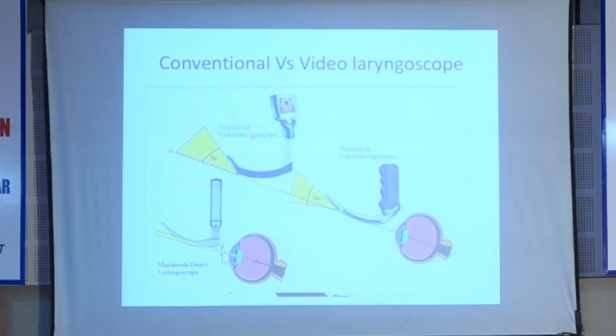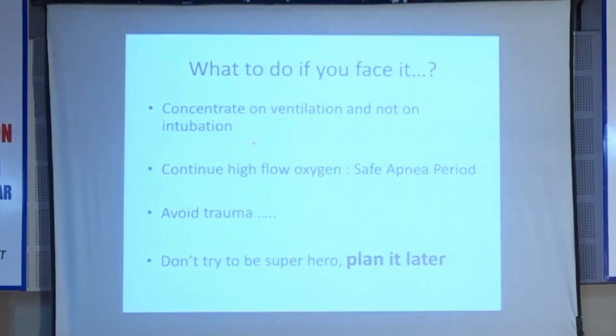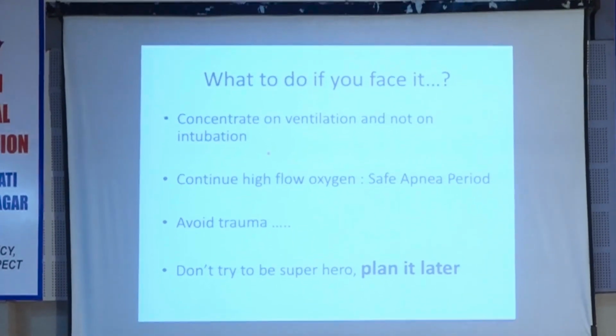The larynx is visible, but intubation is a bit difficult because there is some learning curve for the use of a video laryngoscope. Now, whenever you face such a situation, always concentrate on ventilation and not on intubation. Intubation is always elective. You can call an expert for that. But if ventilation is a problem, you are going to be in a soup. Patient will not die of hypercarbia. Patient will die of hypoxia. So avoiding hypoxia is our primary aim.